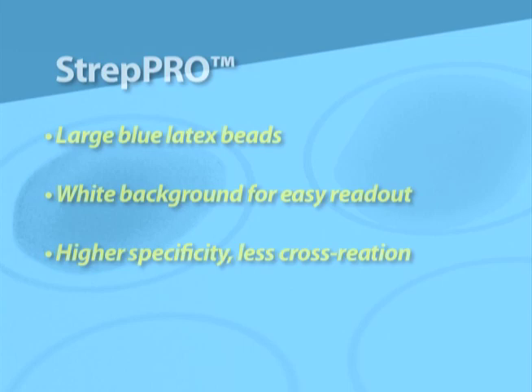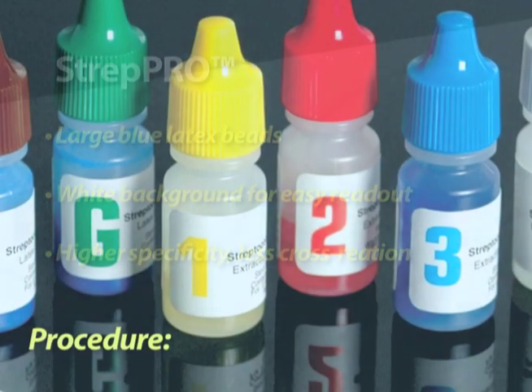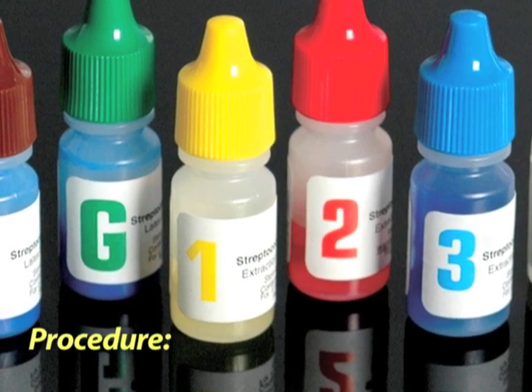Also, the large blue latex beads on a white card make it especially easy to read. The simple procedure is as follows.